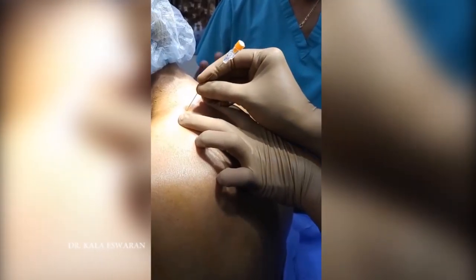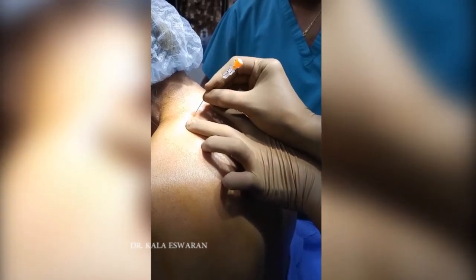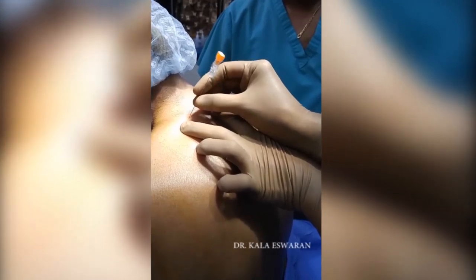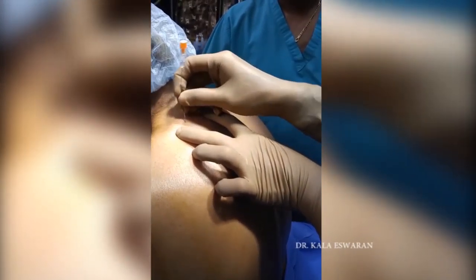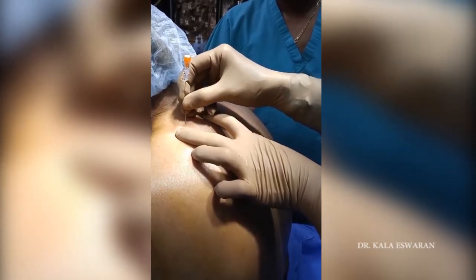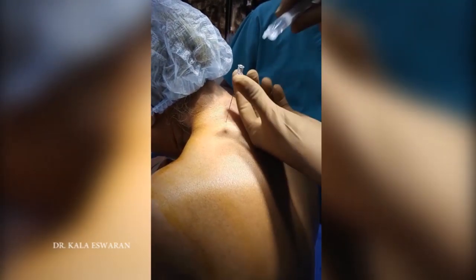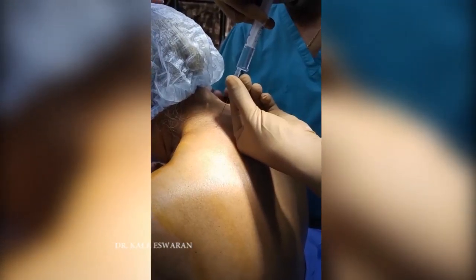Keeping my finger on the superior aspect of the spinous process and 3 cm lateral, I hit the transverse process going perpendicular to all planes from the skin. After hitting, I go caudally. Then 3 cc of that mixture is injected.